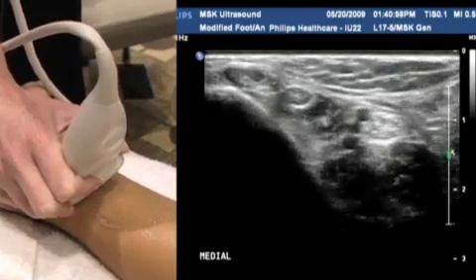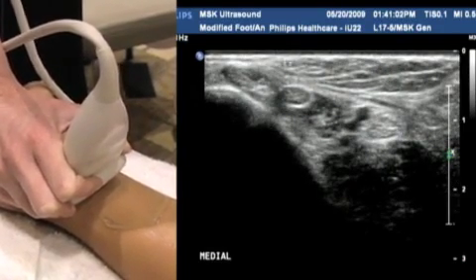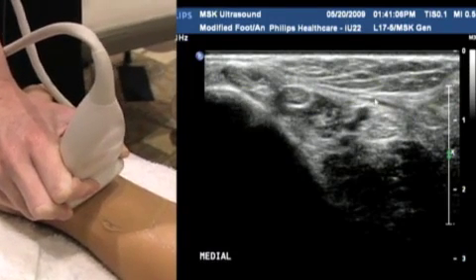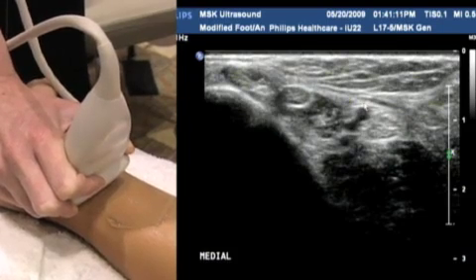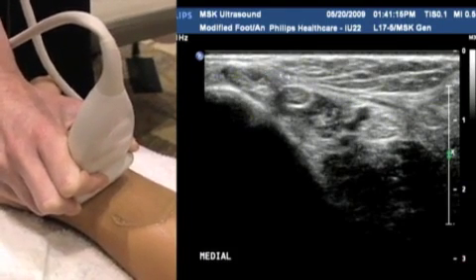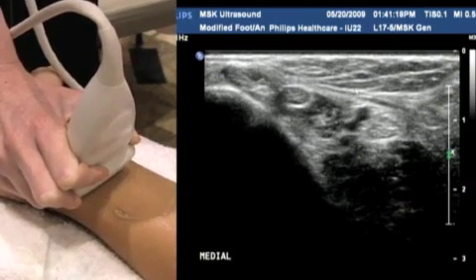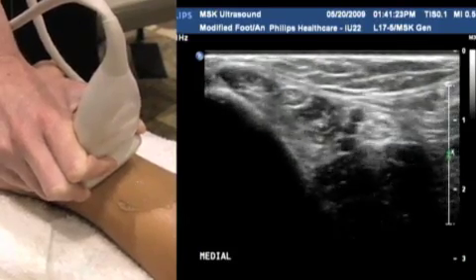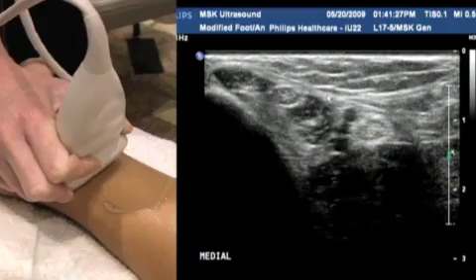You can see stretching out above the tarsal tunnel, encapsulating it, is the retinaculum. Looks a little bit like a ligament extended right over the top there. Again, you want to make sure that that's intact and creating a superior margin over the tarsal tunnel. It can become interrupted, it can become discontinuous, and you can get fluid collections here. So really important to make sure you assess the retinaculum lying over the top here.